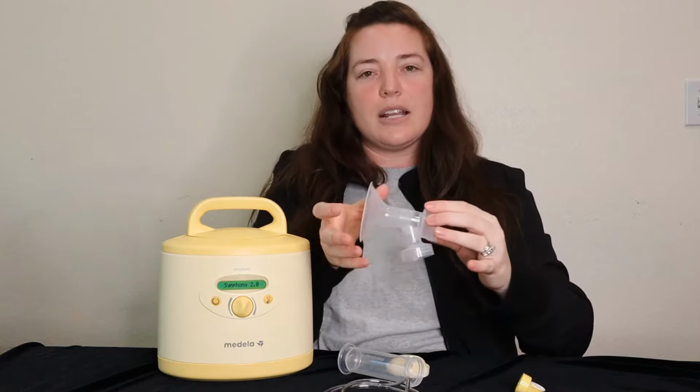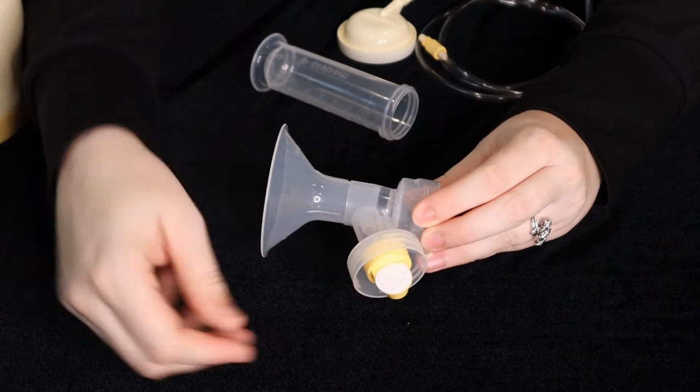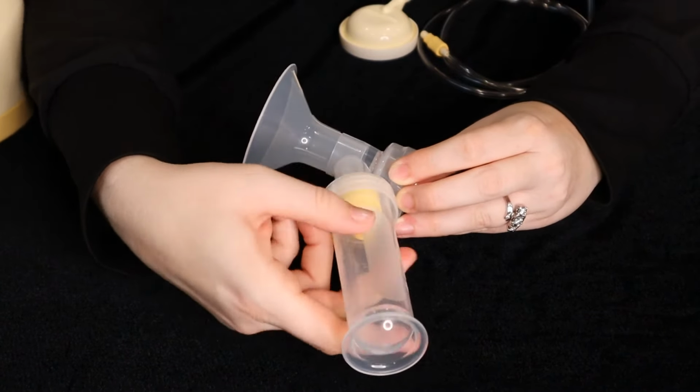So I'm going to take my connector. It already has the flange in there, but it goes in this part that points upward. We put the membrane on this bottom one and then attach our bottle. Just make sure everything's in there good and tight.